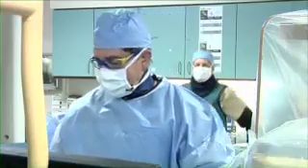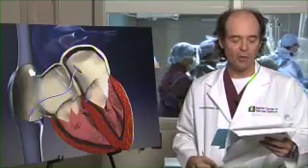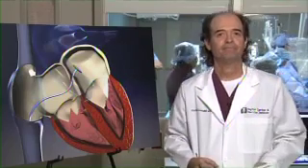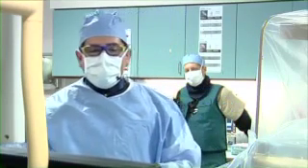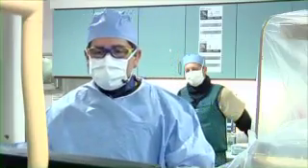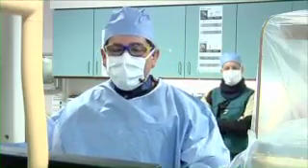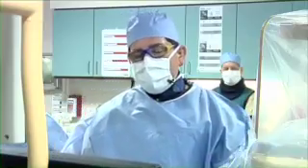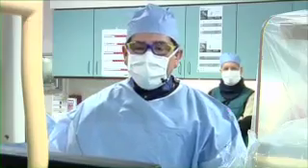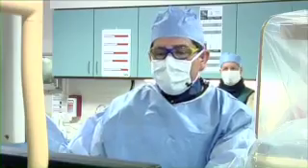Another question I think is great. Is general anesthesia used for the procedure? And can you explain what the recovery is like and how long you're in the hospital after the procedure? This patient is sedated, what we call conscious sedation. We make her comfortable, but she's not under general anesthesia. Babies, they use general anesthesia because obviously, and if I were to use transesophageal ultrasonography, we'd put a catheter in the esophagus. Those patients we put under anesthesia, but for this type of procedure we mostly use intracardiac ultrasound.